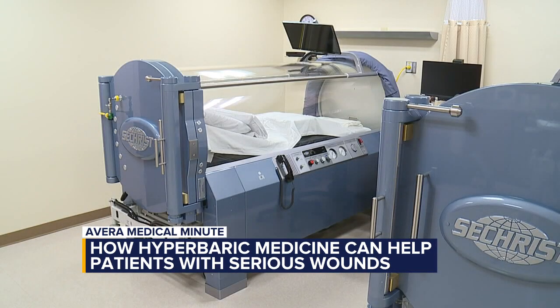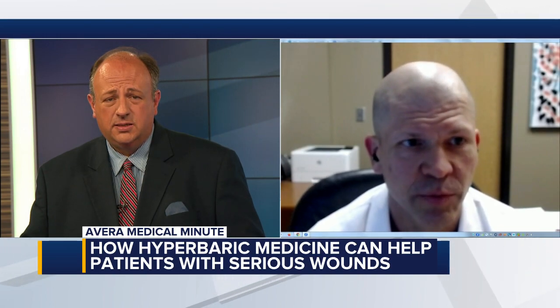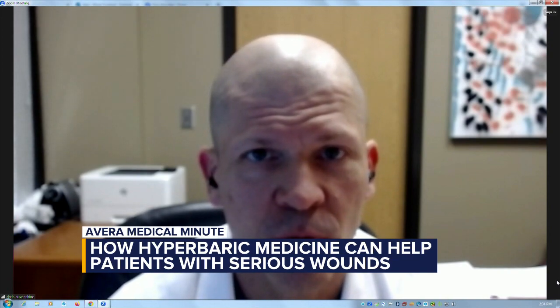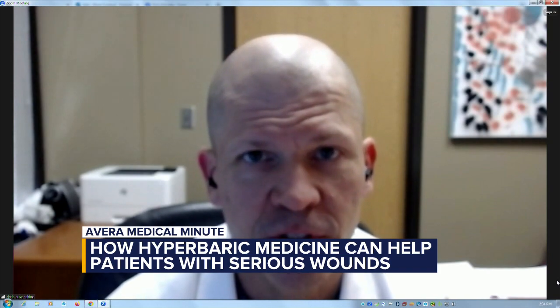How does it promote healing? How is it helpful? Sure. So we take patients and place them in our hyperbaric chamber. We have them breathe 100% oxygen, and then we will pressurize the chamber to 2 or 2.5 atmospheres of pressure.